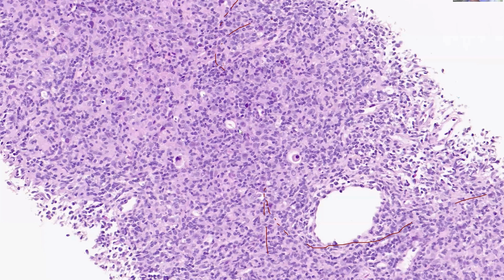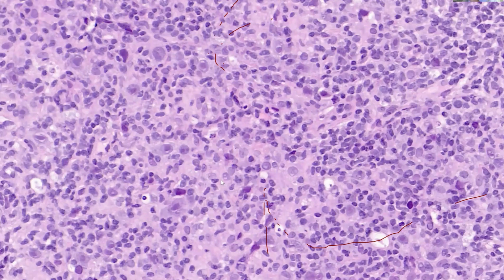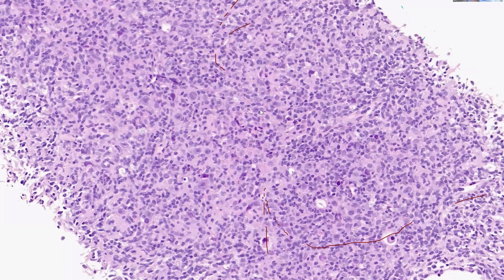So you can see a mixed population, mainly histiocytes, as well as small lymphocytes, with cells that have prominent nucleoli. And these cells don't show the expected full expression of CD30. CD30 was weakly positive in most of the cells.